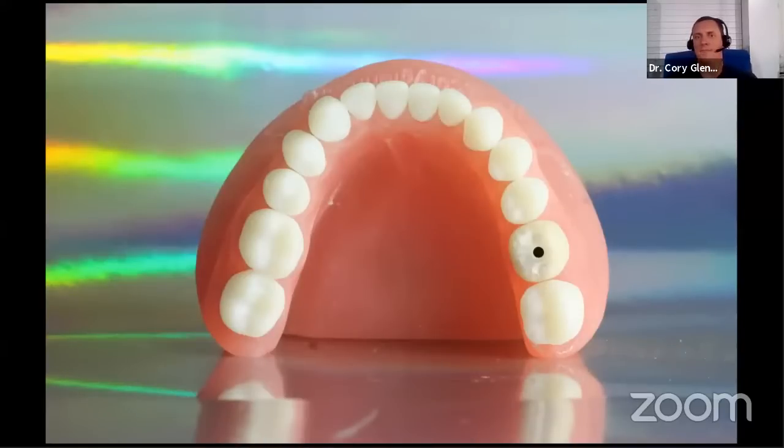And if you want to create a molar emergence on an implant that you've placed, well, you could just design the crown to full contour and then simply grind the occlusion down. And now you have a custom temporary. And if the tissue heals to that exact shape, well, then you can just go and print or mill again the same shape. This time, just don't grind the occlusion off. And now you have your final restoration. So it can really streamline your workflow on that.